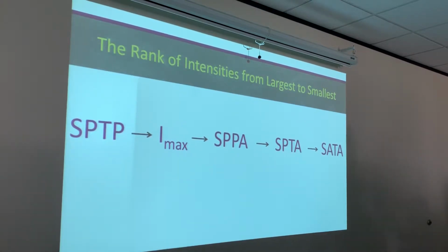Manufacturers measuring intensity. So the most intense one, of course, is going to be the peaks. Peaks are always going to be the highest value, the highest amount of intensity. Spatial peak, temporal peak, that's going to be the highest intensity.